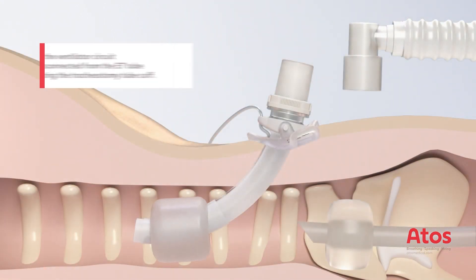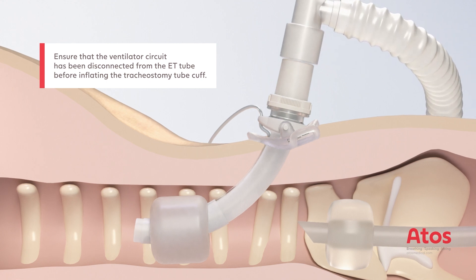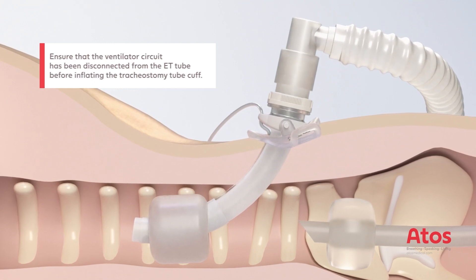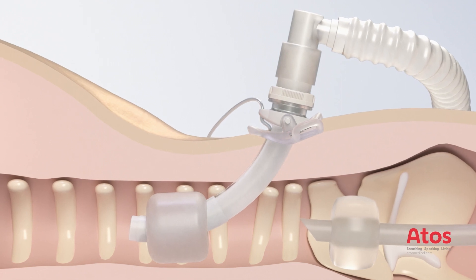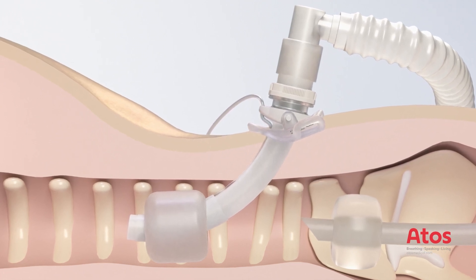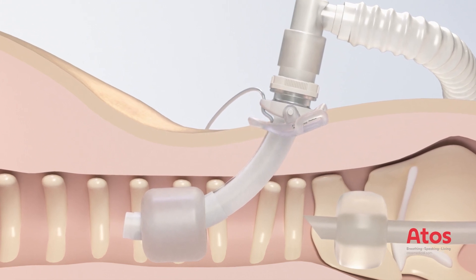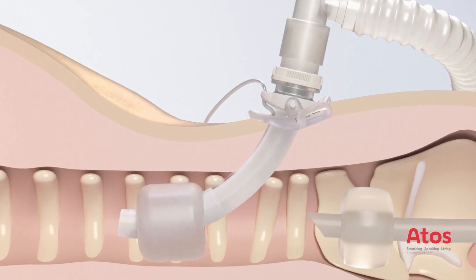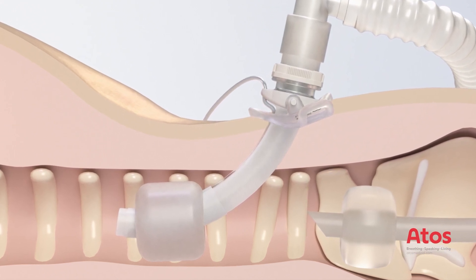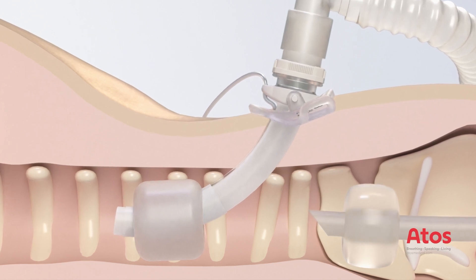Inflate the cuff of the tracheostomy tube, disconnect the ventilation tube from the ET tube and attach it to the 15 mm connector of the already situated non-fenestrated inner cannula. The position of the tracheostomy tube is confirmed via the ventilatory circuit using a fiber optic camera. In addition, another fiber optic assessment is carried out via the ET tube. If necessary, correct the position of the tracheostomy tube during the checkups.